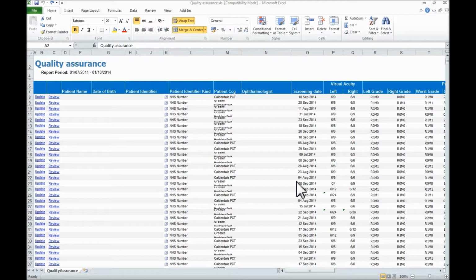Hello again and welcome along to the second of 4 short videos that deal with grading performance monitoring data extracted from the OptoMize version 4 system and gathered using the quality assurance report and the program performance report.